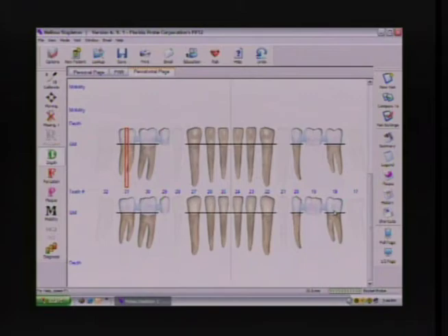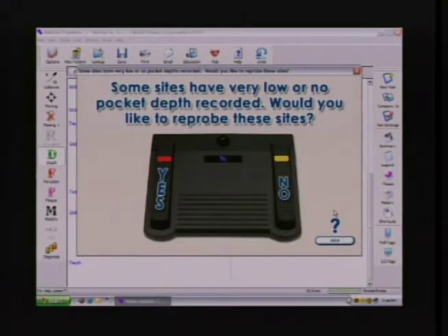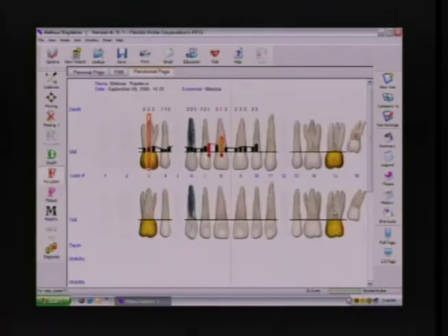Okay, we are at the end of the mode. Stretch, let the patient close their jaw. Everything all right? Let's quick tap advance with the foot pedal. We know that we had some zeros, so we'll say no. Upper arch. Furcation. And it went into the next mode, in this case, furcation. Quick taps advance. Midline. Advance to 15.